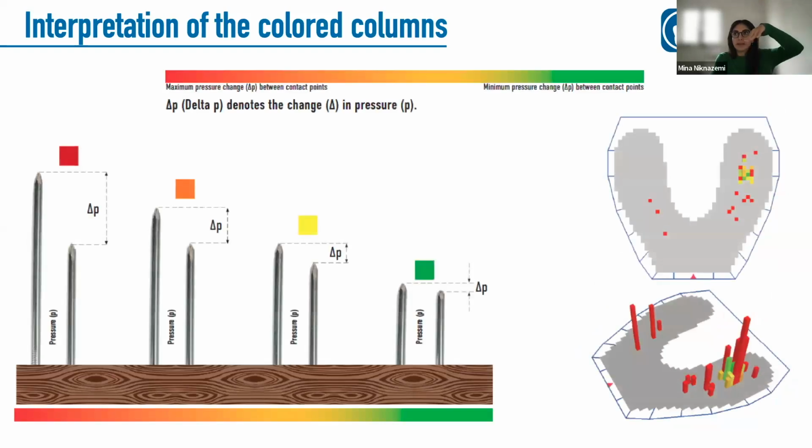So this is a punctual contact if the neighboring contacts have less pressure. So with OccluSense readings, you have to always remember that they are not absolute pressure changes that are being given to you, but relative. So all of the pixels on the sensor are constantly being compared to neighboring pixels on the same sensor. Those pixels are the same as the needles.